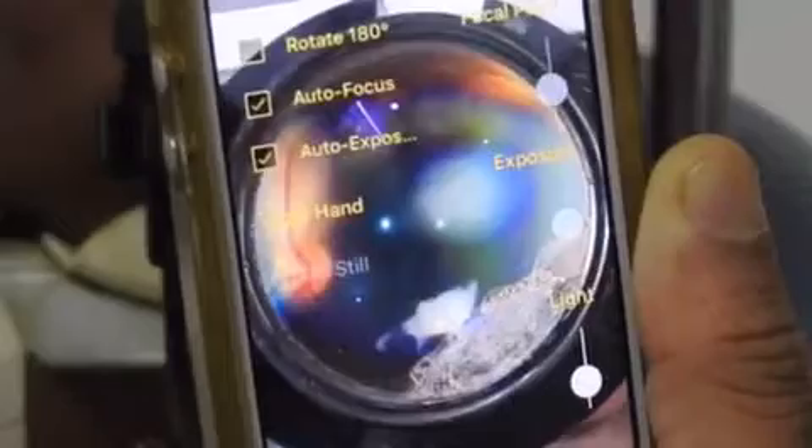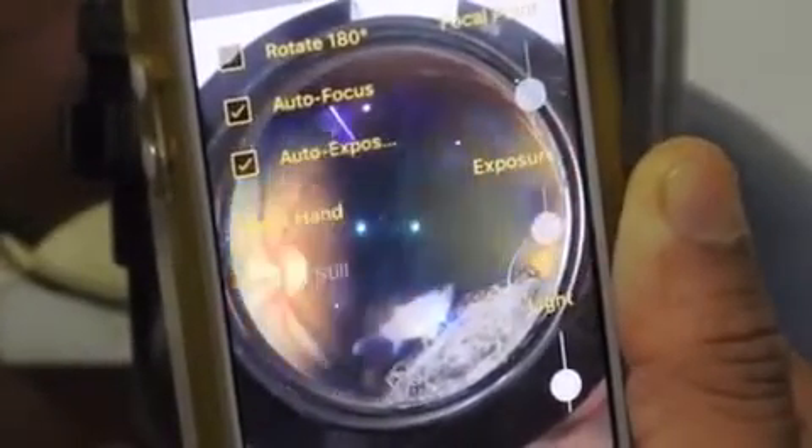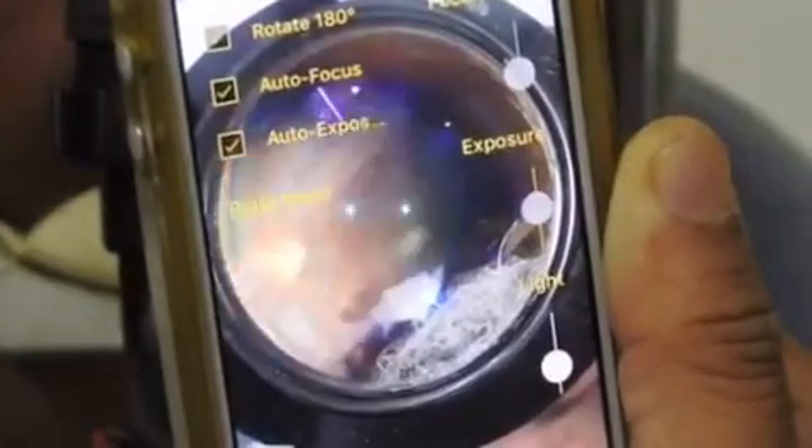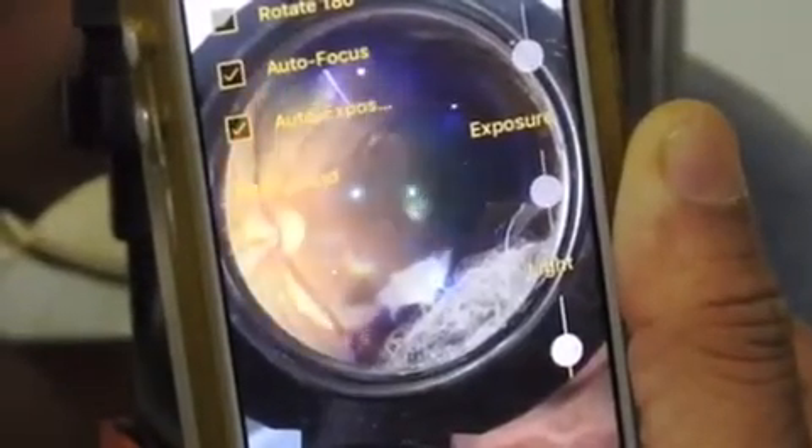Now the patient is examined on the slit lamp with pupils fully dilated. The red glow in the pupillary region is followed back till a clear picture of the retina is imaged on the screen of the mobile phone. The retinal images are then recorded either in video mode or photo burst mode of the Ulman Indirect app, and the best images are saved to the gallery.